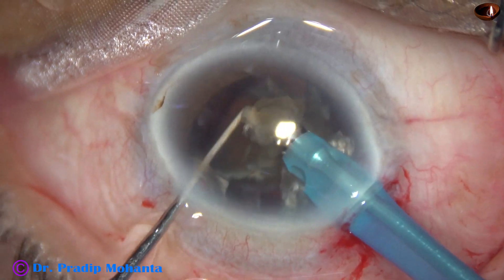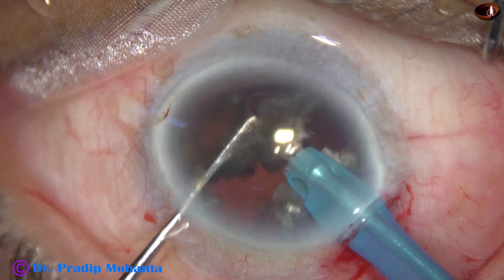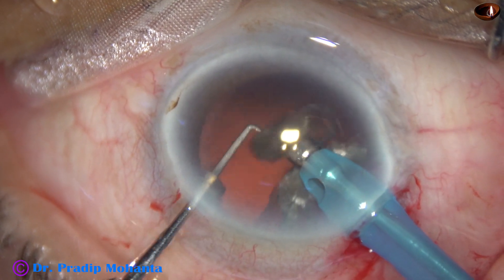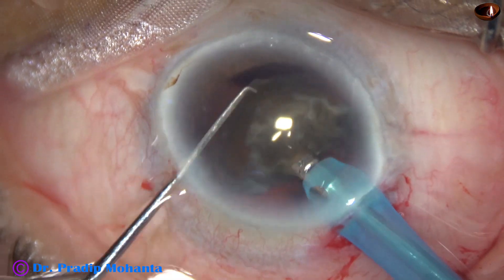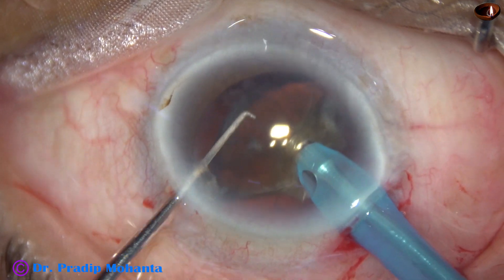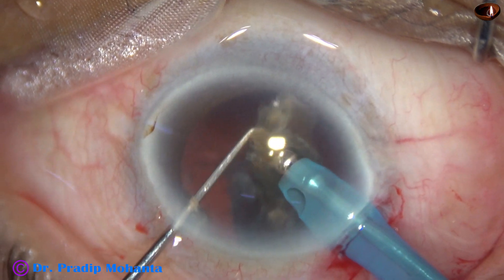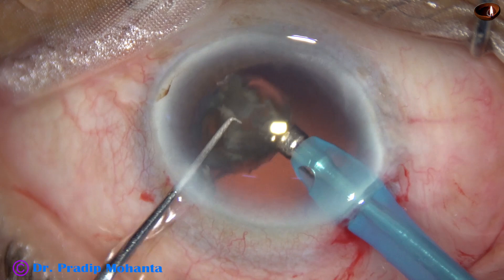This is the larger piece of the hemi nucleus. It is subdivided into smaller pieces and the pieces are emulsified. All the pieces are brought to the center of the anterior chamber at the iris plane and then emulsified. This is the last nuclear piece — at this time extra precaution is taken. The last piece has been divided into two pieces.